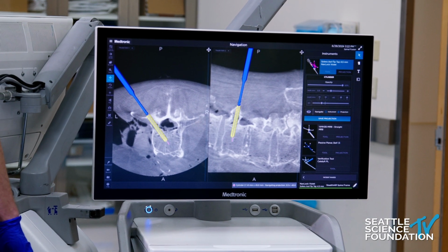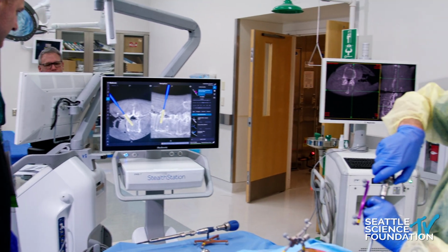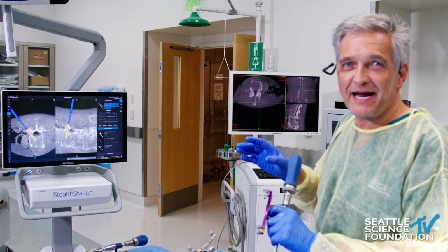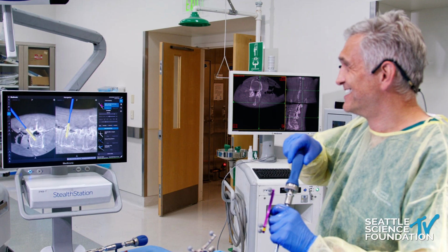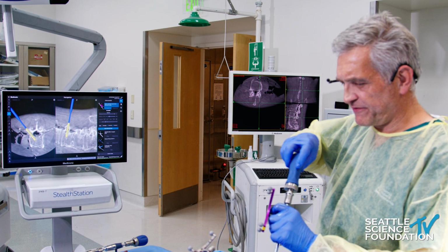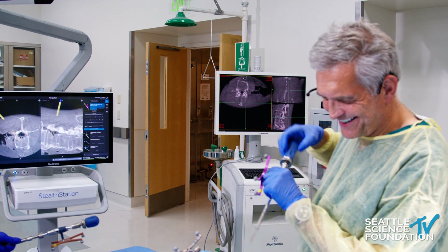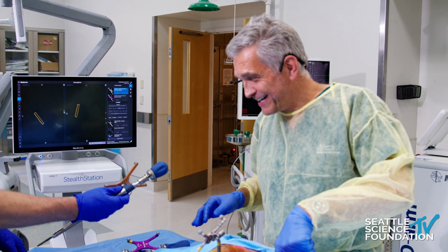What X-ray, Christoph? There's no X-ray. We don't need X-ray. The whole point is nobody wears lead here, and there's no X-ray. The X-ray is banned, and the X-ray techs are banned. That's the whole point. So there's no secondary verification except for your magical... No, you don't need it because you feel everything. I put my finger in. Where else am I supposed to be? I know exactly where I am. Now I know what time it is too because I've done it for a while.